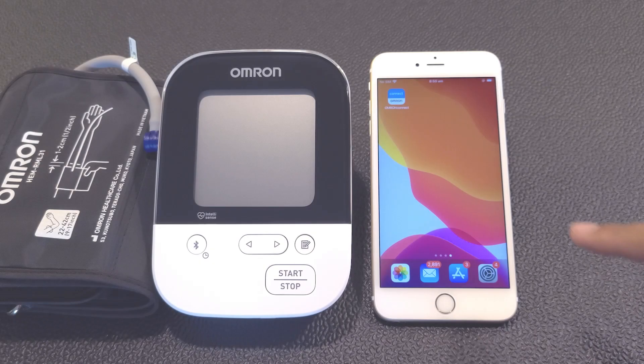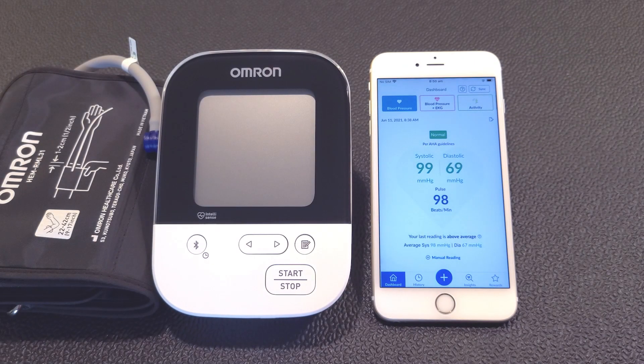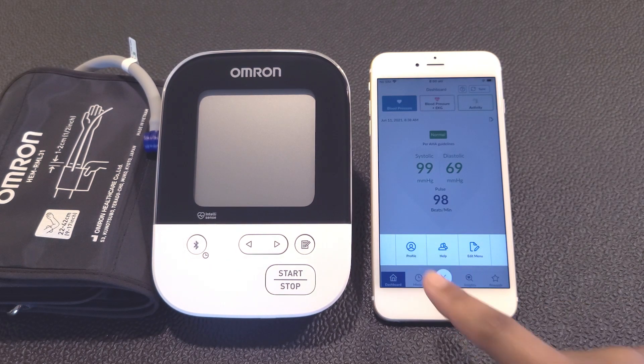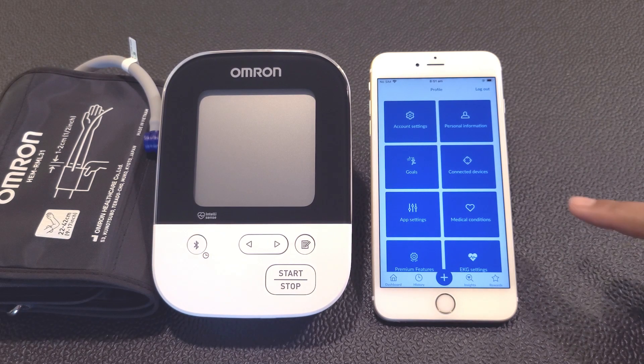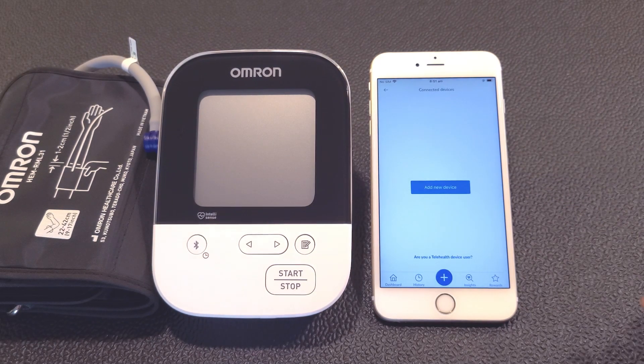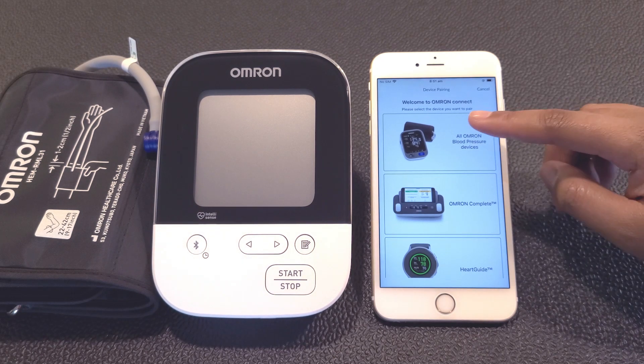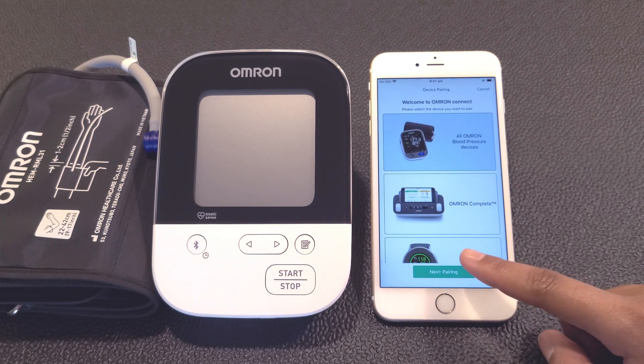Now open the Omron Connect US Canada app. Tap on the plus sign icon at the bottom of the screen and then the profile icon. Select the Connected Devices box and tap the Add New Device button. From here, select the All Omron Blood Pressure Devices box, then tap on the Next Pairing button.